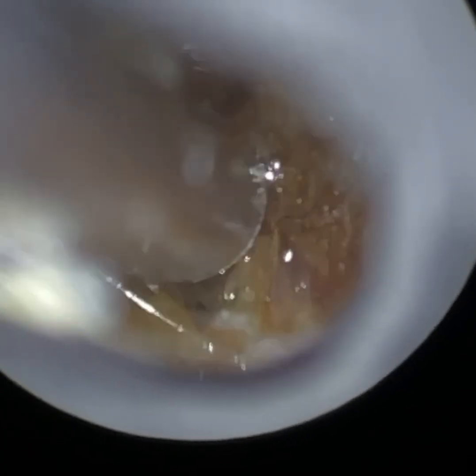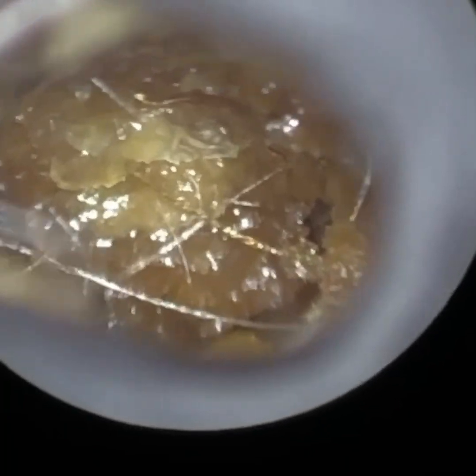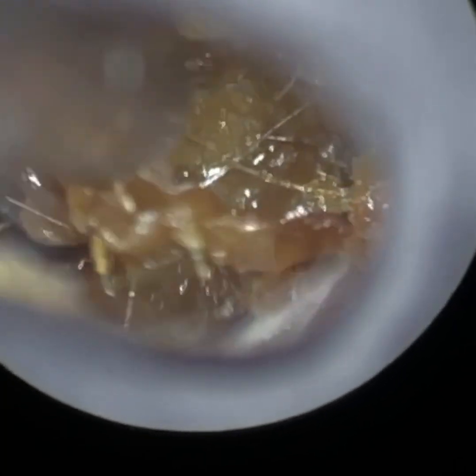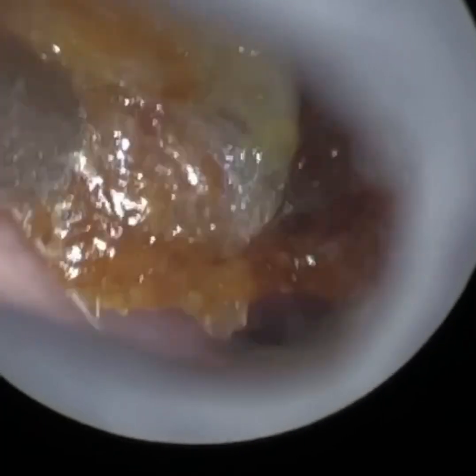We've cleared the outer part of the patient's ear canal — they had really thick, crusted dead skin. Now we're working medially, and the patient has a really, really narrow ear, hence why we're using the 3.5mm speculum, the smallest one. I would not have been able to remove this when I first got trained with head loops — it was just not possible. It was too deep, it would have been blurry, I wouldn't have got the view and I wouldn't have felt safe. But here I'm in complete control. I feel completely at ease removing this, and you'll see we're removing some dead crusted skin directly off the eardrum, similar to the left ear.